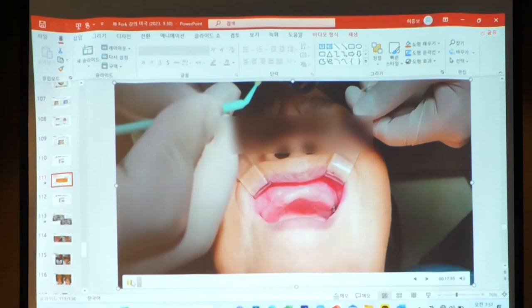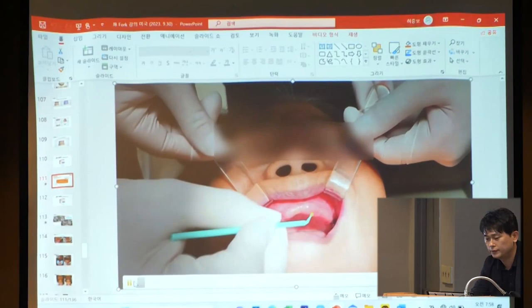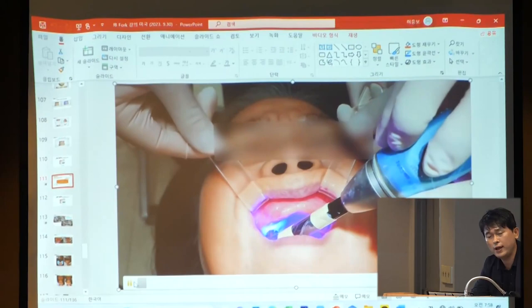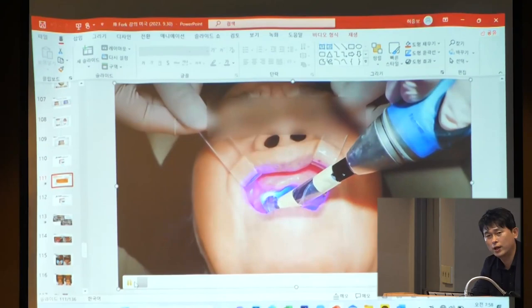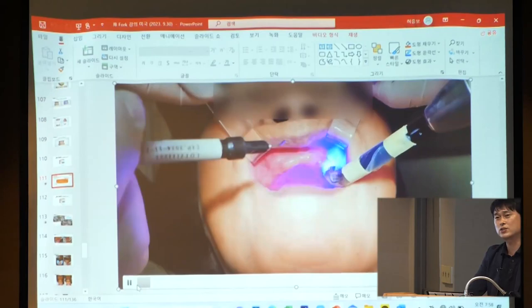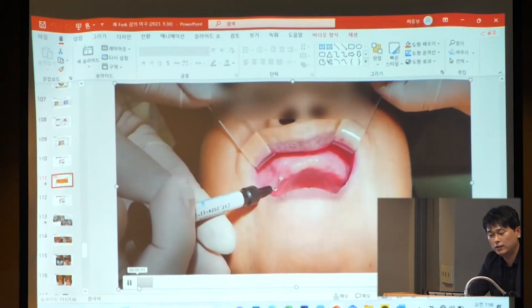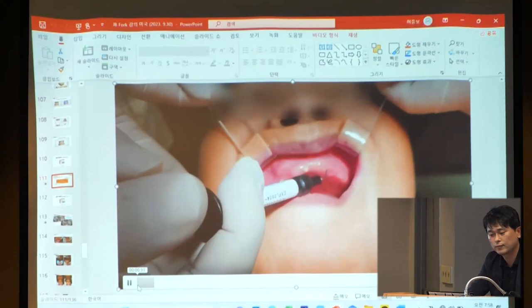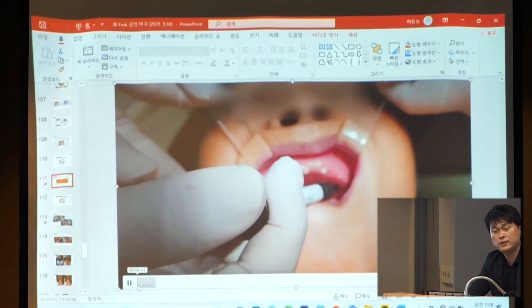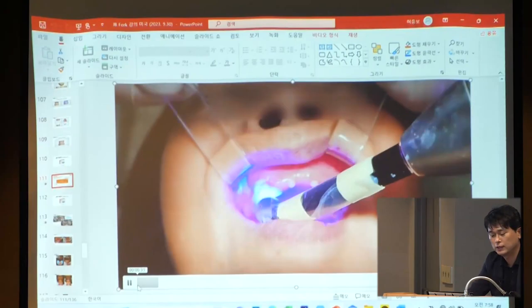This is a real-time video. So apply adhesive in the area where you want to make the reference point. Without adhesive application, the resin tag detaches very easily. Yeah, so then curing. To be honest, Superbond is best. But we have to wait about 5 to 8 minutes to cure, so I don't like this. I like the dentin bonding system and dentin adhesive. And then inject the flowable resin like this. Three points is best, but I worried about the detachment of some references, so I made 5 references. That is real time, so it's not a burdensome procedure. It's very simple. Yeah.